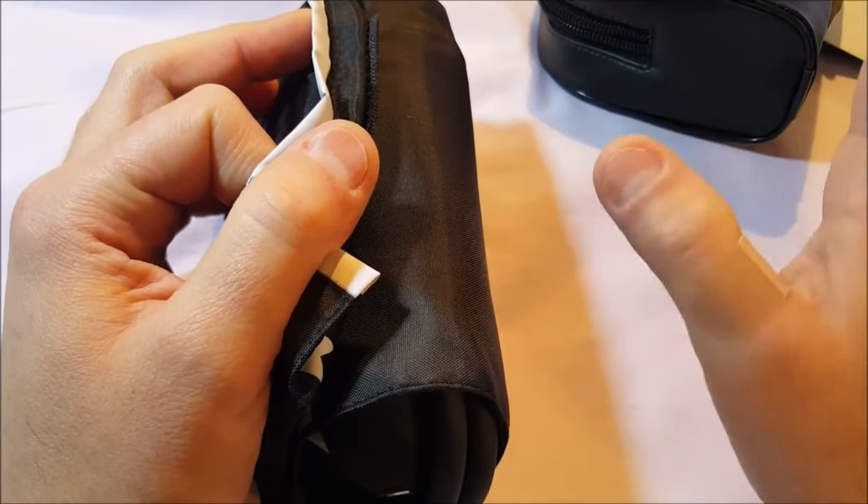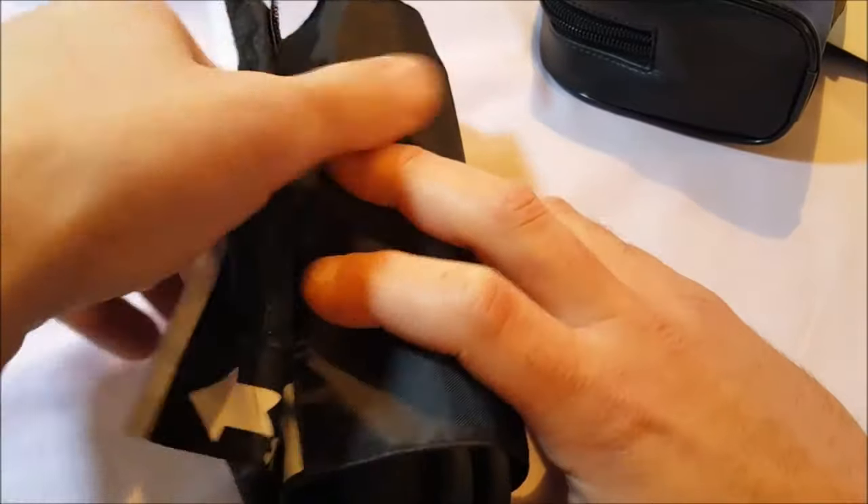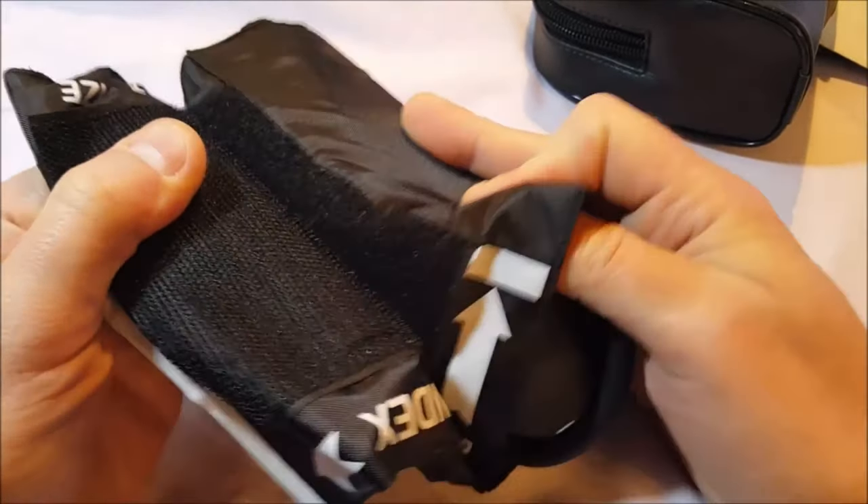The manometer exceeds industry standards for accuracy. It has a nylon cuff and aluminum alloy manometer — I hope I'm pronouncing that right.